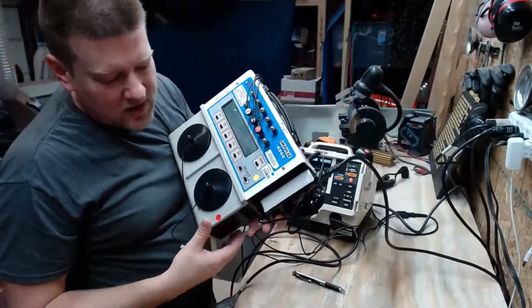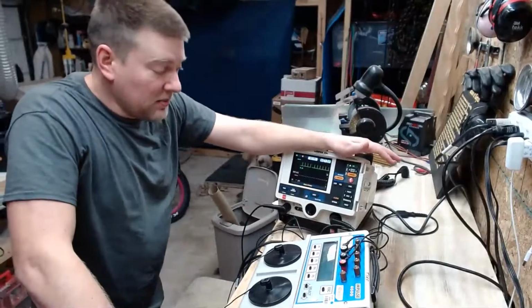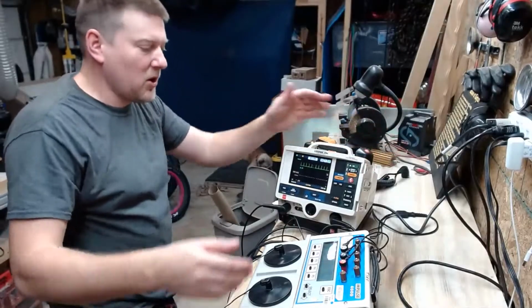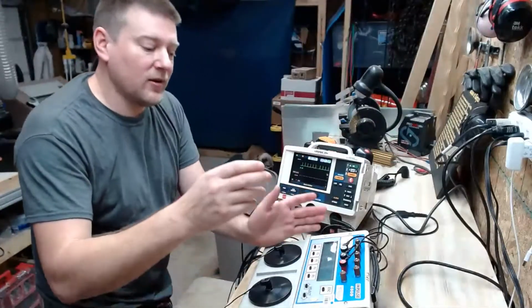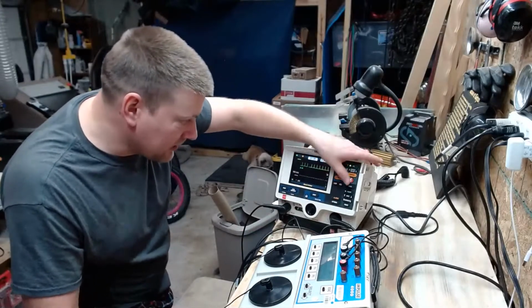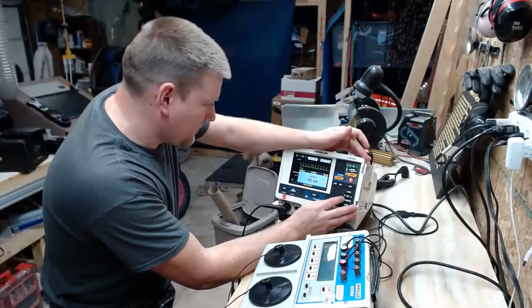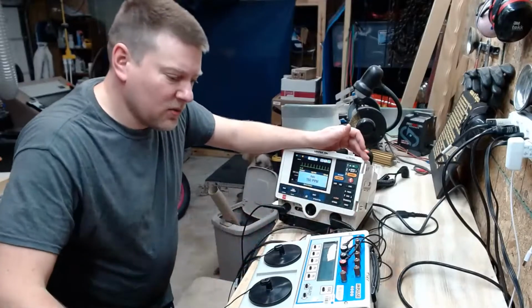So these are all things that you're going to document in your work order. You want to make sure that the pacing mechanism can keep up to its maximum load. Its maximum load is 200 milliamps at 170 ppm. So you're going to start there. I'm at 203 milliamps at 170. Then I'm going to take the current down. Let's take it down to 150. Take the ppm down to 150.